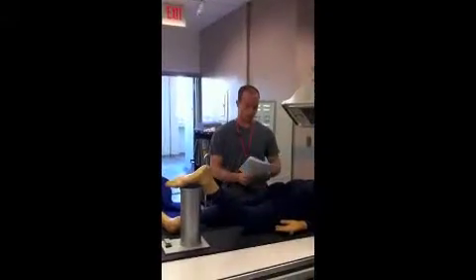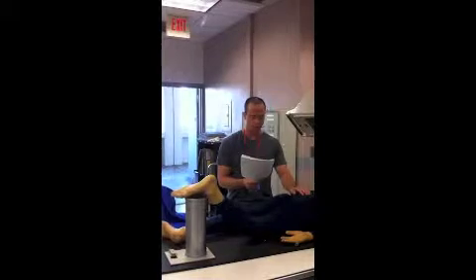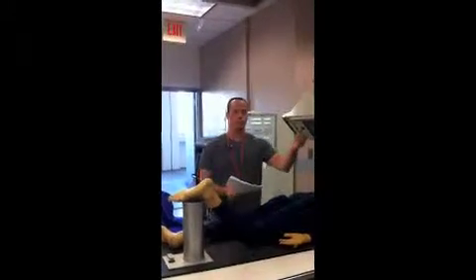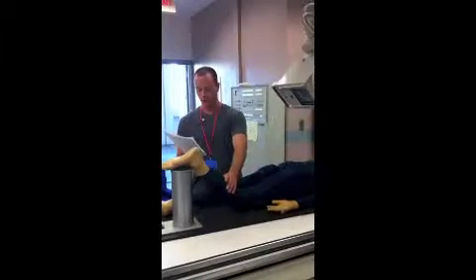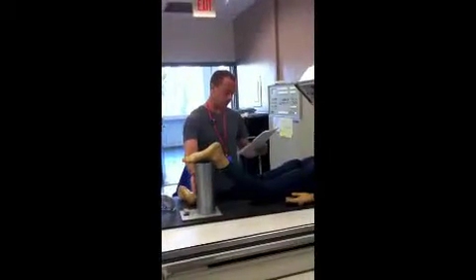All right, this last one is for the PA axial knee. We'll be using the Coventry method, also known as the tunnel. Again, the SID is 40 to 48 inches. The patient's position is prone. Position of the part is the patient's knee flexed 40 to 50 degrees. I check with a protractor. Foot resting on support. You center the upper half of the IR to the knee joint.